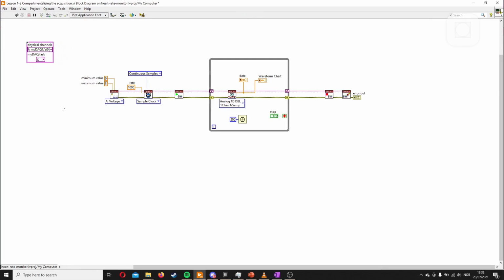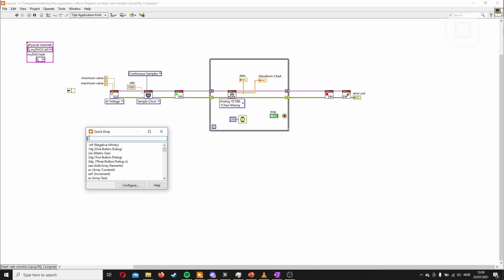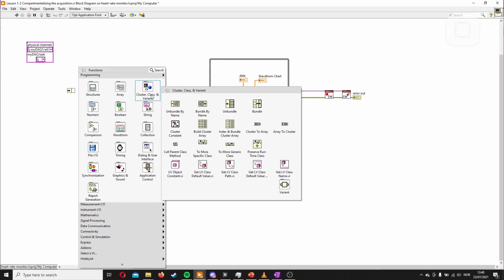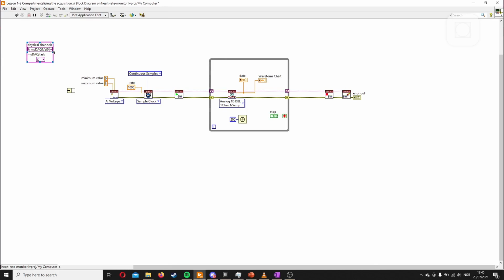And to start, we'll just use an unbundle by name. To get this menu up, you hold Control and press space, and then you can search for anything. You can also find these cluster things here, and unbundle by name, which we'll be using a lot. So we'll connect the cluster up here. The channels come up. You can see all of them here, but we only need the physical channel. There you go. Oh, I connected it wrong. So connected where the other one was.